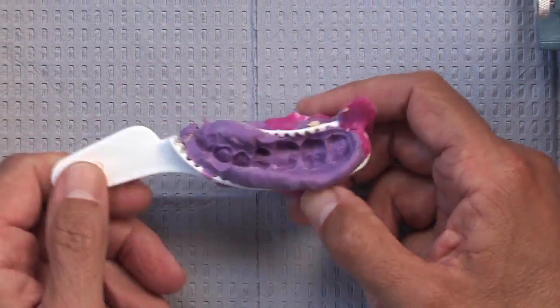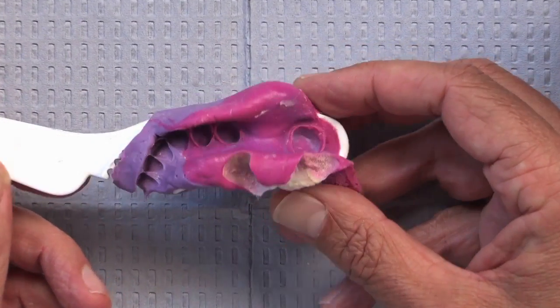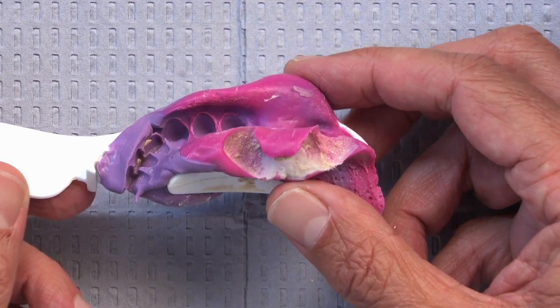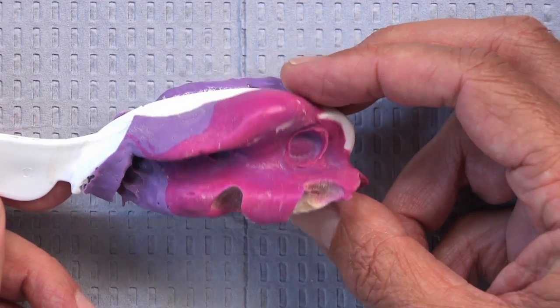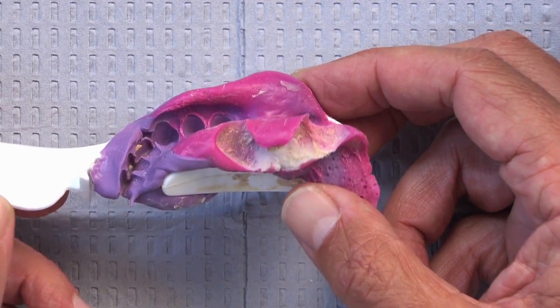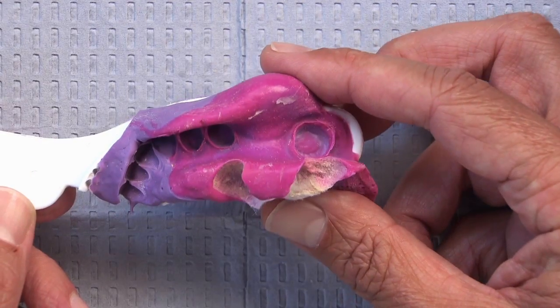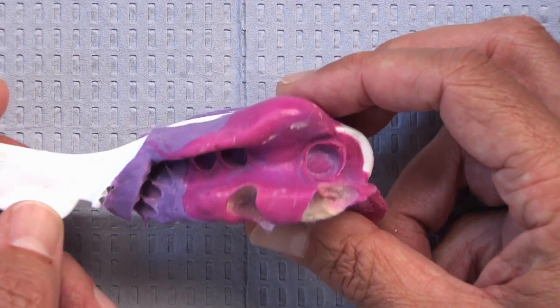The first thing you'll notice is that it's a double arch tray that was used, and it was a plastic one. It's kind of hard to rag on the plastic one here as being the main offense because of the fact that we're just not big fans. We followed Gordon Christensen's recommendation, which is that you should never use a quadrant double arch tray like this for anything bigger than 2 single units next to each other.